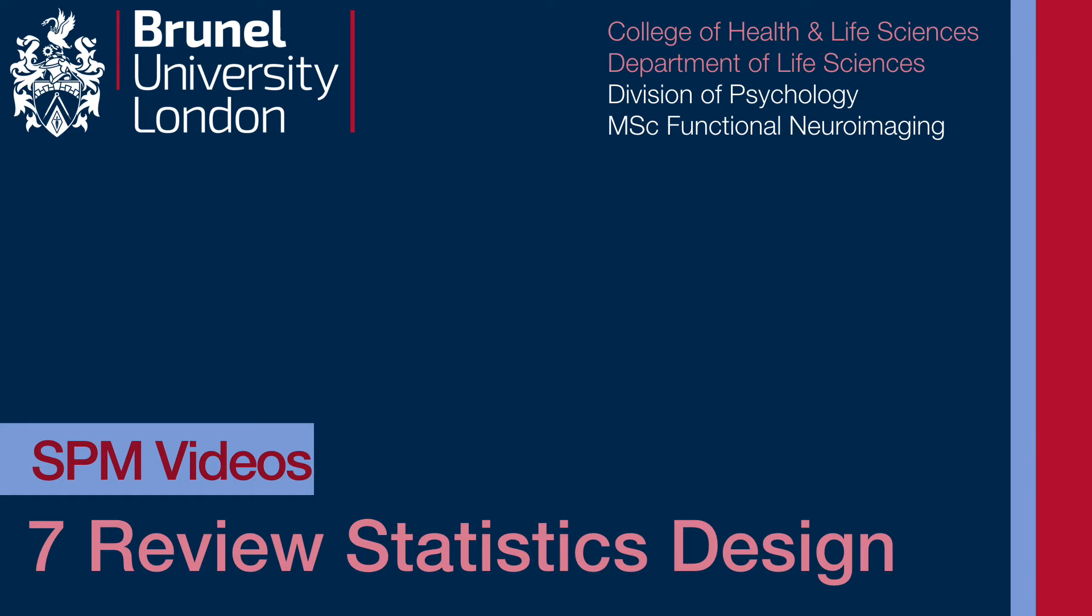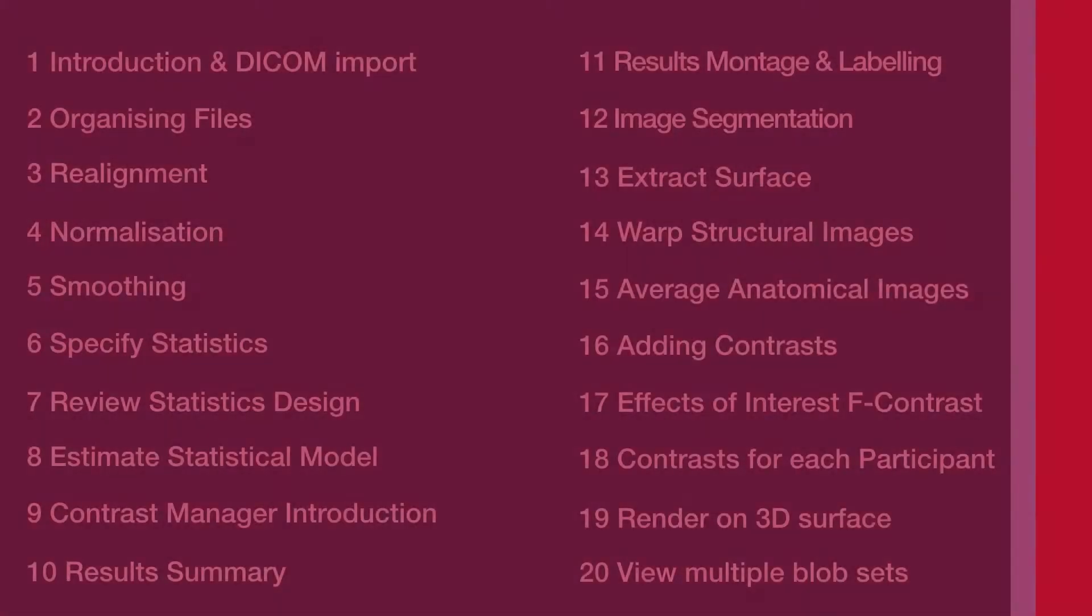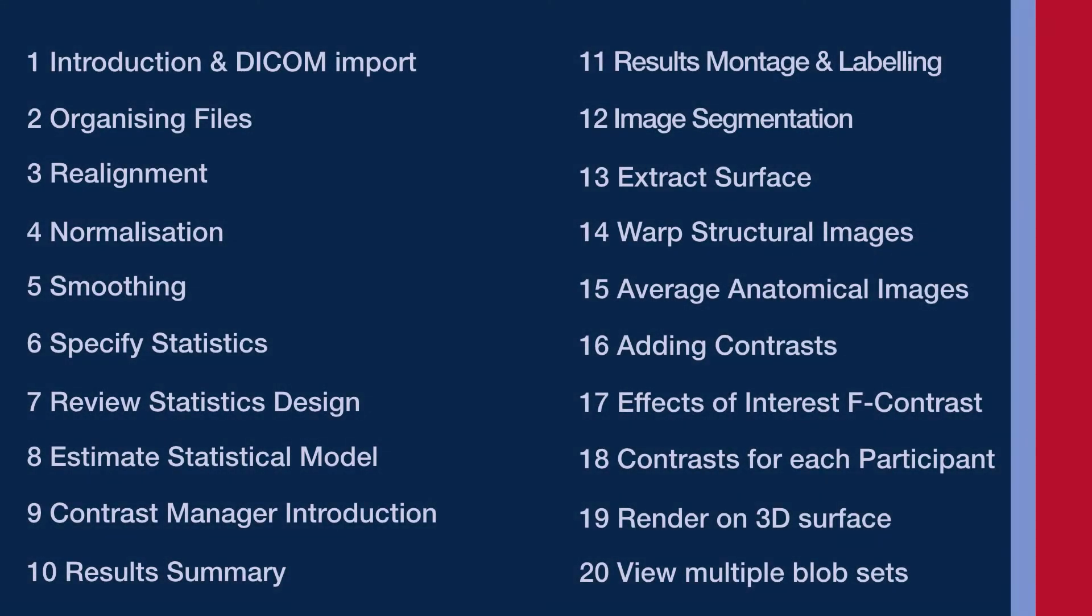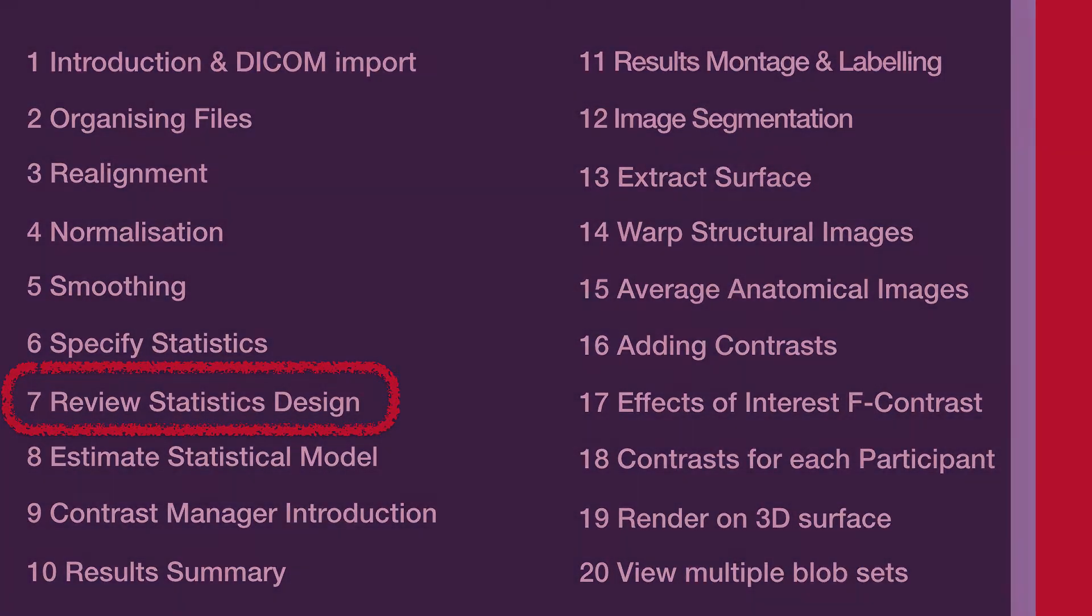After the rather lengthy stats specification video, time to breathe for a second, take stock and have a look at what we've done. This one is for reference really, just so you know how to check that your statistics design is okay, see what regressors have been put in and check that the timing is correct.